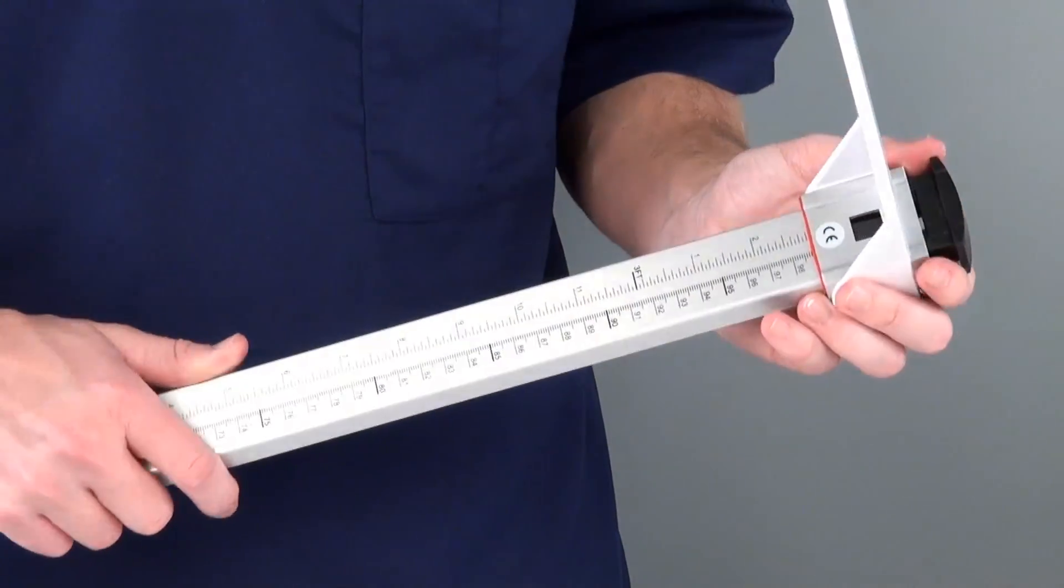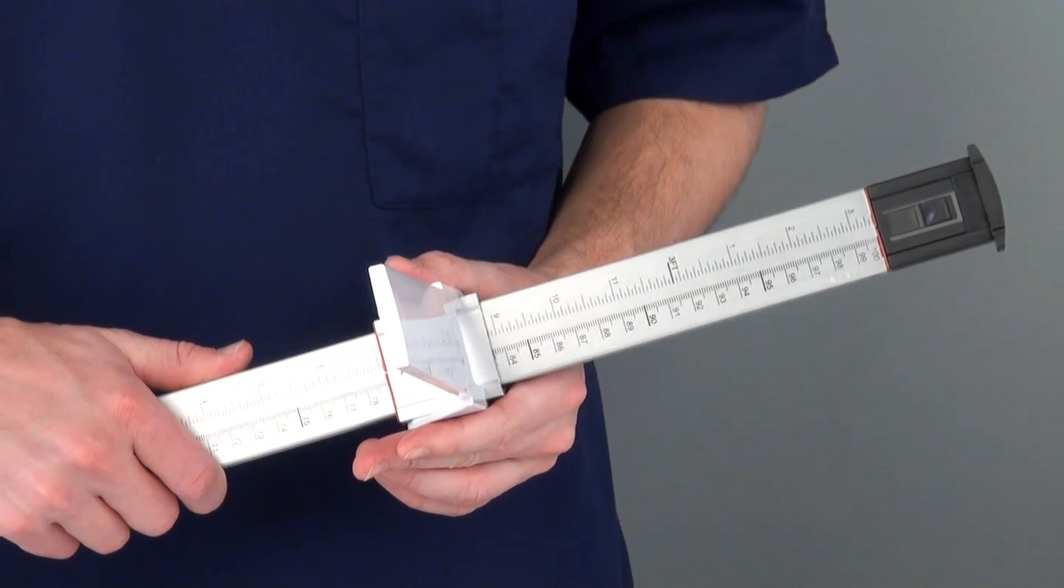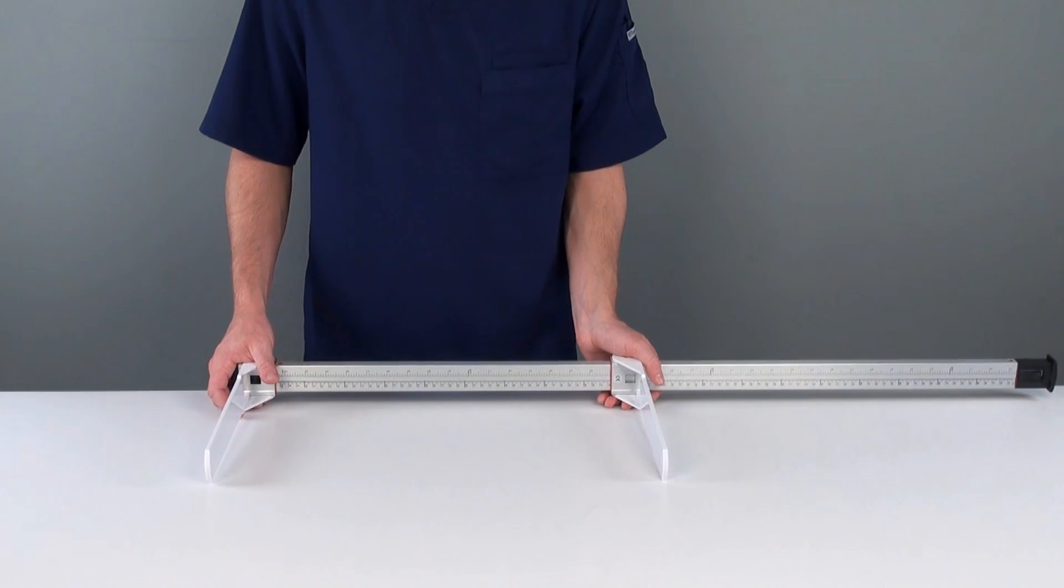Fold out the stadiometer's calipers located on either end of the measuring bar, extending them into place, one end against the top of the young patient's head and the other against the soles of their outstretched feet.